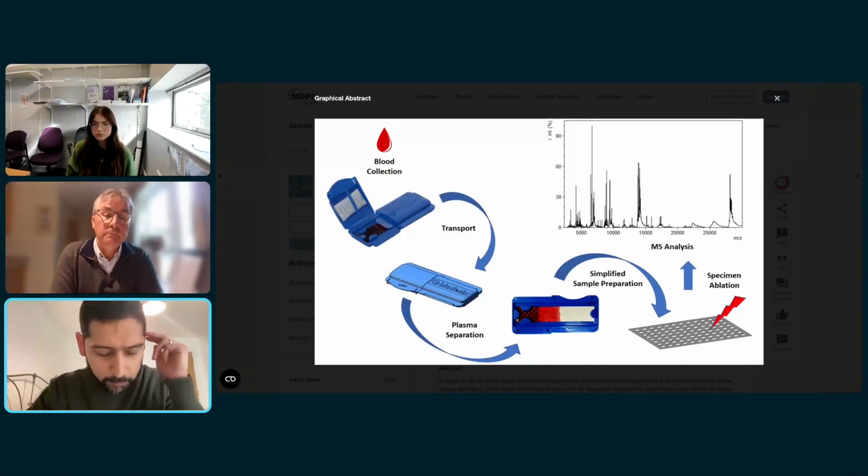In answer to your question, the Biodexis device itself does not collect blood in a volumetric manner. So it's not a VAMS.